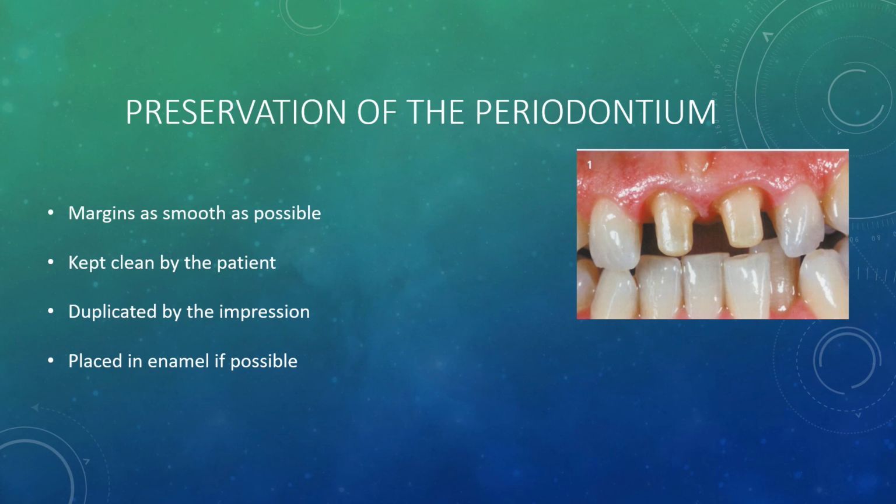And also we should try this. Certain times you might see that your tooth has some restorative material. If there is any restorative material, we might end up placing a finish line on the restorative material. But you need to understand that there is a difference between your restorative material and your enamel, right?